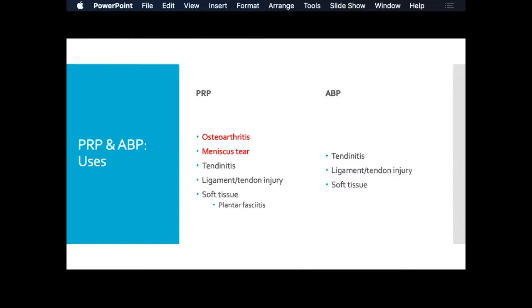I'm sorry? And you can't do that into a knee, is that correct? Into a joint? I wouldn't do that into a joint. No. Because of the whole blood? Yeah, yeah. You don't want to give them a hemarthrosis. That'd be super painful.